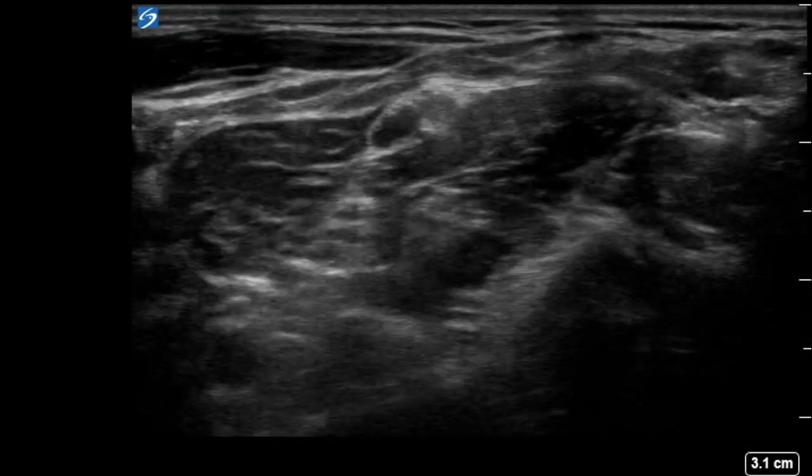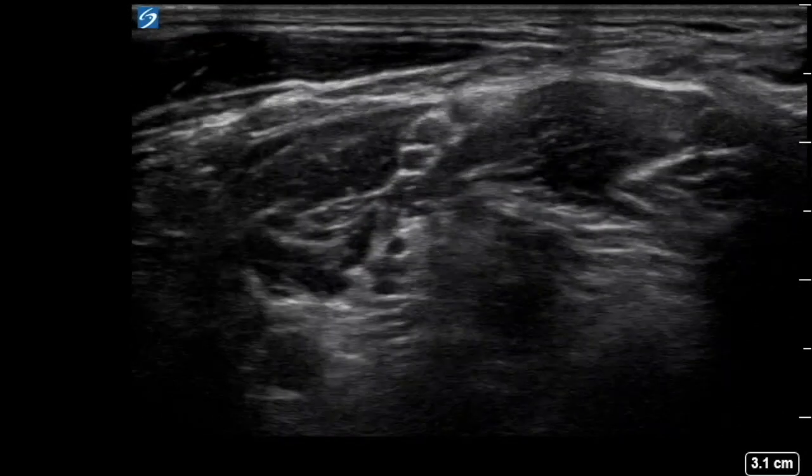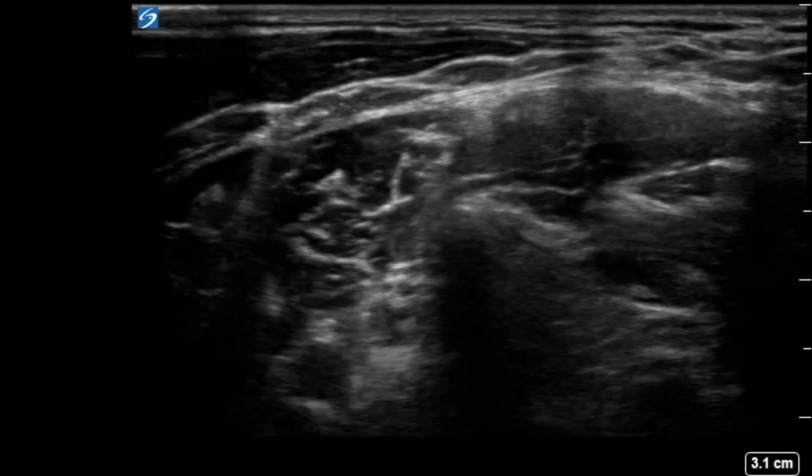If you continue to scan cranially from here, you'll see the nerves disappear into their respective foramina, which have characteristic appearances. The C7 transverse process has a large posterior tubercle and absent anterior tubercle due to the vertebral artery.